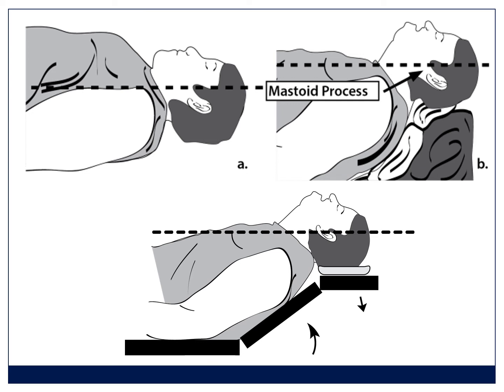So the patient in picture A is lying flat, and you can see that that ear is too low. You've got to ramp that head up, and you can either do that like in picture B with pillows and blankets, or you can do it with the actual head of the bed. Some of the beds will allow you to get it up at 25 degrees, and then you just put the final bit at the head parallel to the bottom section of the bed, and that will also allow you to do this. And you should do this in every single patient. If you have a difficult intubation and you have to reposition your patient, you have to ask yourself afterwards, could I have done that better? Because you must position the patient perfectly the first time.